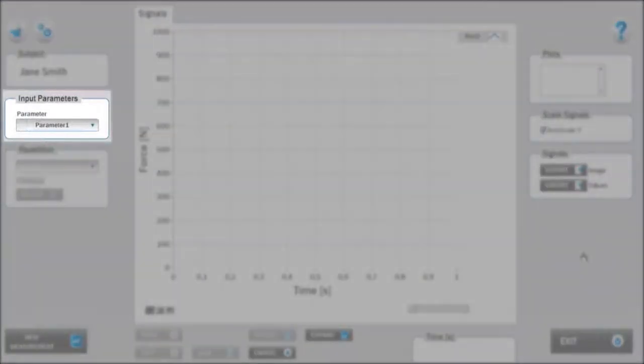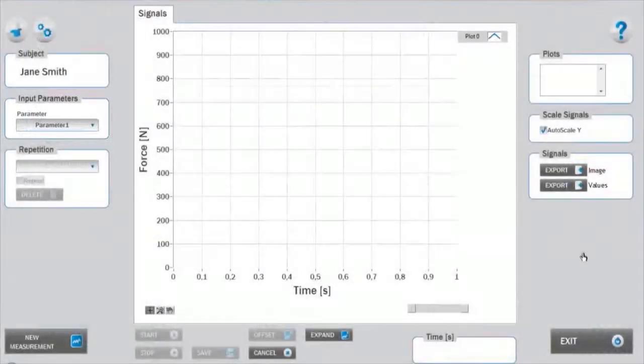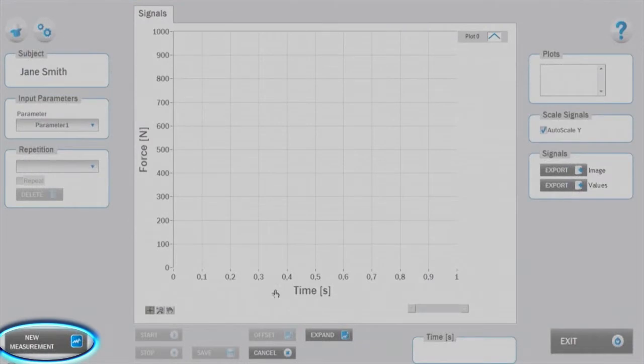Before starting with the measurements, you can select the input parameters that you defined in the settings sections according to your specific needs. To start with the measurement, click on new measurement.